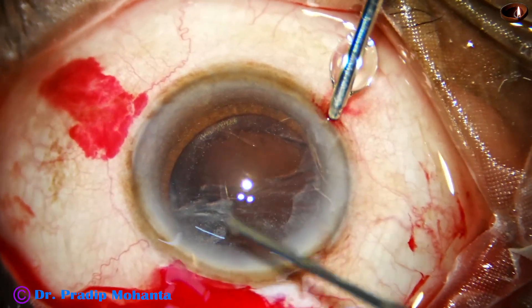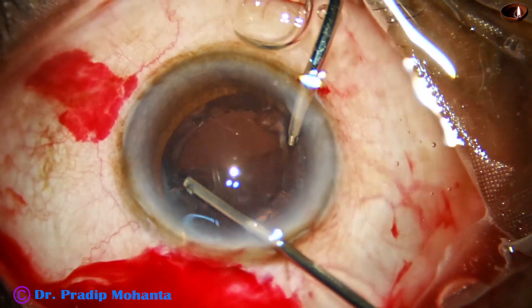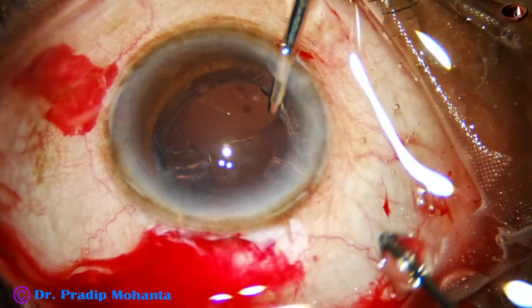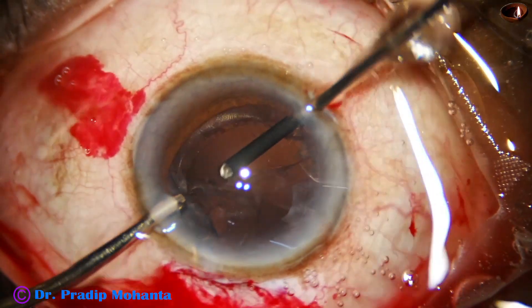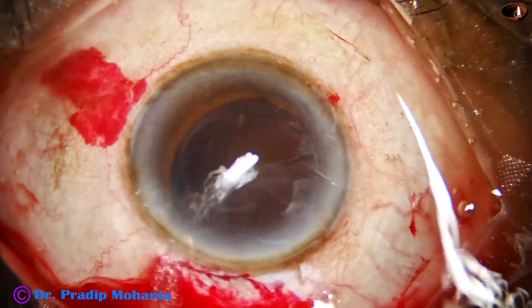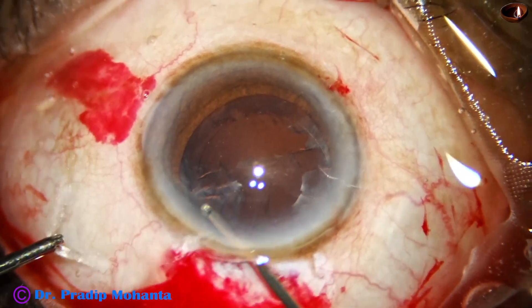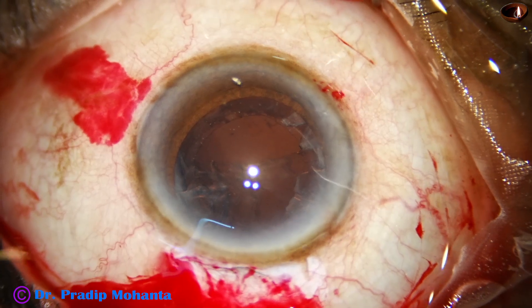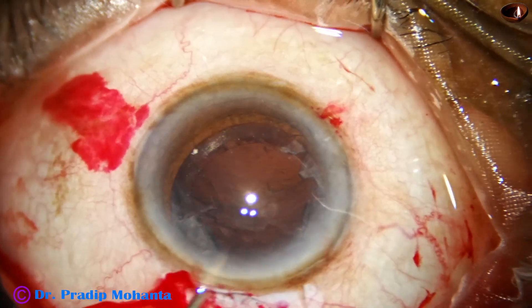I am irrigating from the eight o'clock sideport, going through the wound at eleven o'clock, and removing cortex from two o'clock. Some vitrectomy is done. Then irrigation from two o'clock and cutting from eight o'clock. Without irrigation, I do some cuts to remove the vitreous strands that came out through the main wound.